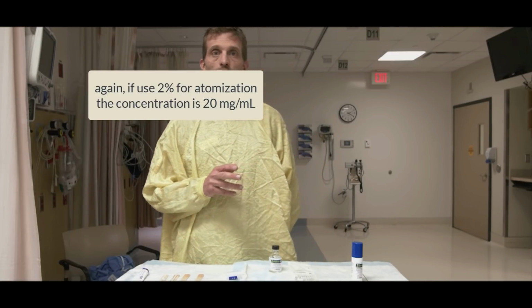Chad's 80 kilos, so that's a 4 milligram per kilogram dose. By anybody's calculation, that's well within a safe dose. Interestingly, we tried this exact procedure with the reverse relationship. Chad's never done this, never done an awake intubation. He's an airway expert at STARS, but he's never done an awake intubation. And I wanted to demonstrate that this could be done on somebody's first try, just with some coaching.